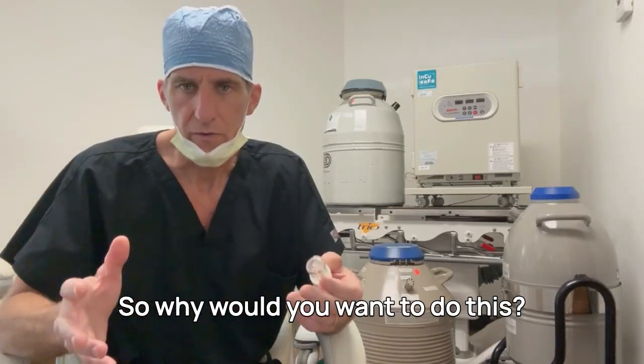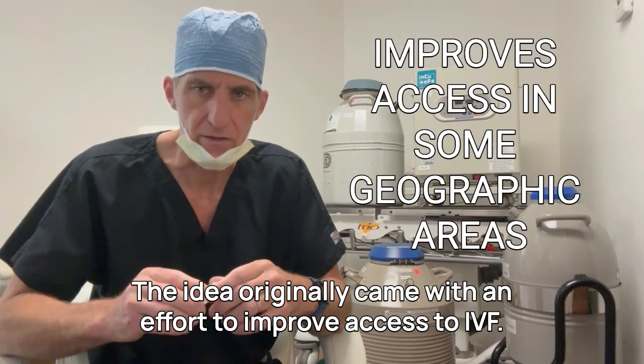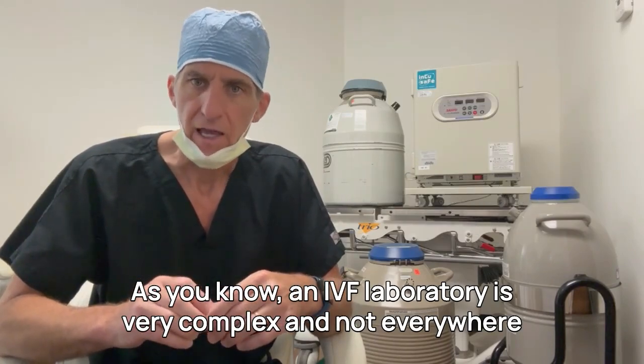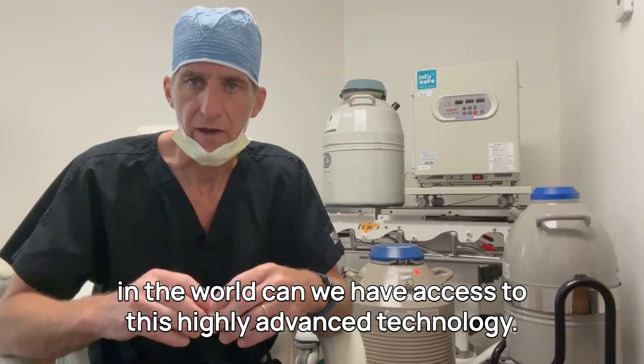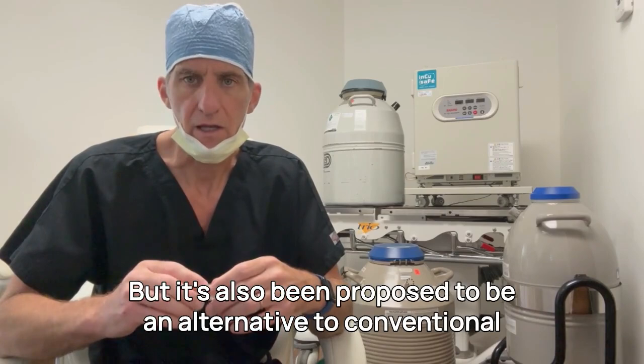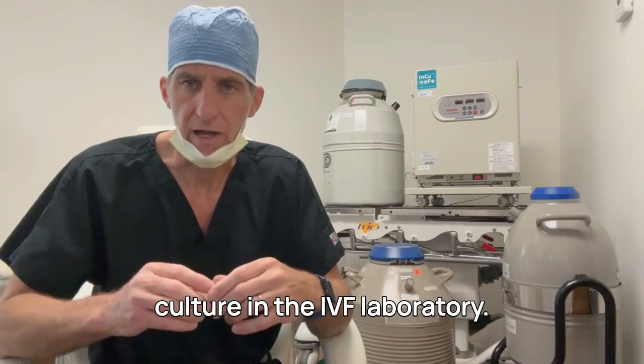So why would you want to do this? The idea originally came with an effort to improve access to IVF. As you know, an IVF laboratory is very complex, and not everywhere in the world can we have access to this highly advanced technology. But it's also been proposed to be an alternative to conventional culture in the IVF laboratories.